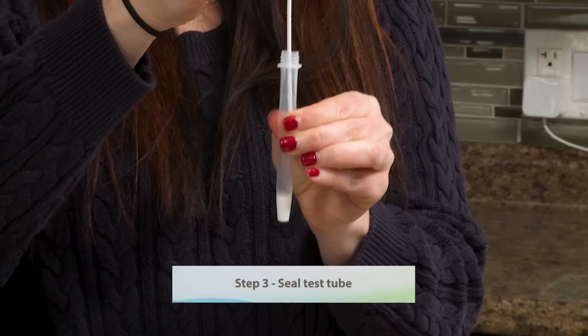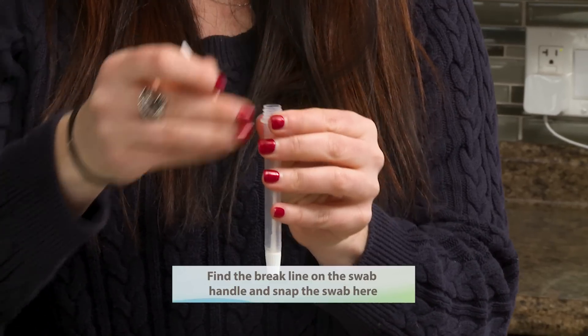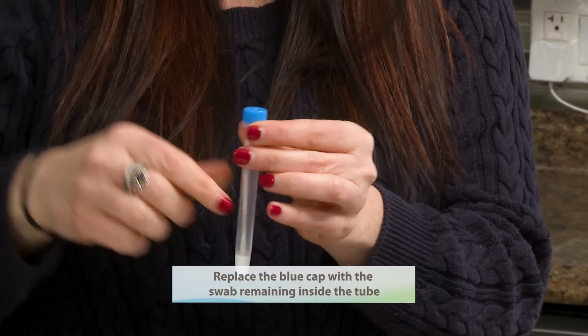Step three: seal test tube. Find the break line on the swab handle and snap the swab at that point. Replace the blue cap with the swab remaining inside the tube.